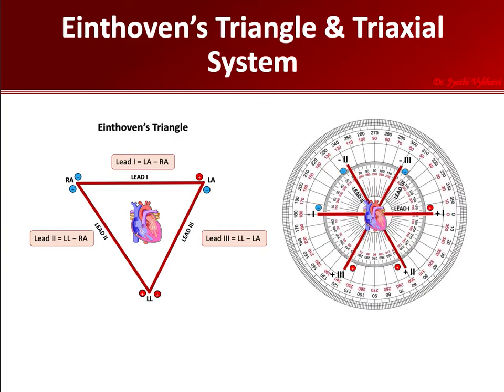So in the previous lecture we understood how Einthoven amazingly invented bipolar limb leads and recorded the first ECG, right? During the first three decades of the 20th century, the 3 lead ECG usage expanded like anything, especially after improvements were made to make it more portable. Doctors started using ECG for everything. Electrocardiograms were initially used to study arrhythmias. In 1909, Sir Thomas Lewis of University College Hospital discovered delirium cordis. This is a clinical diagnosis of irregular heartbeat, and this was a result of atrial fibrillation.